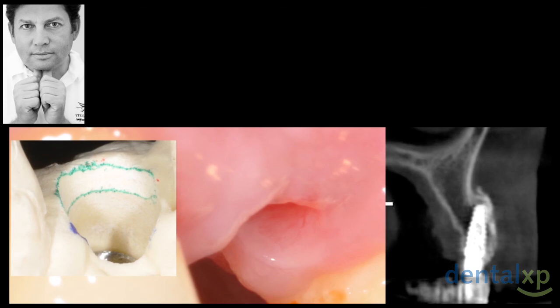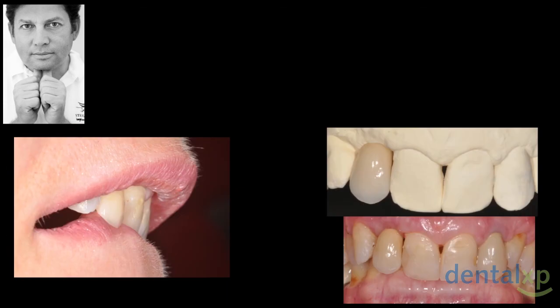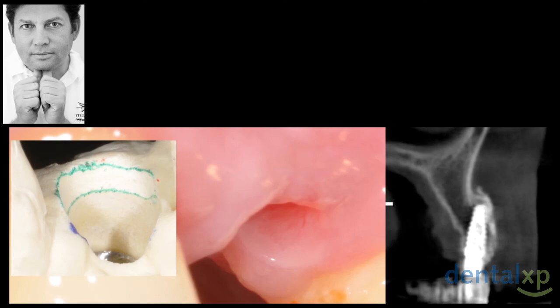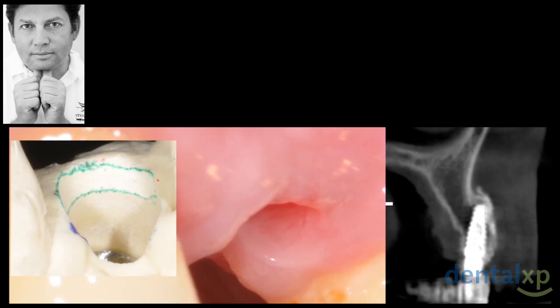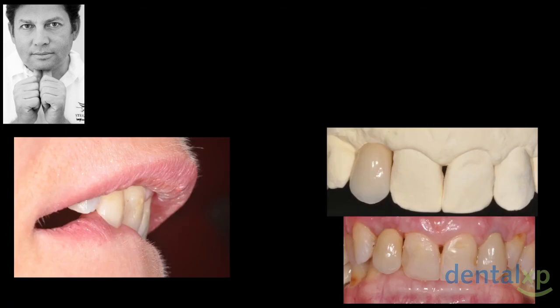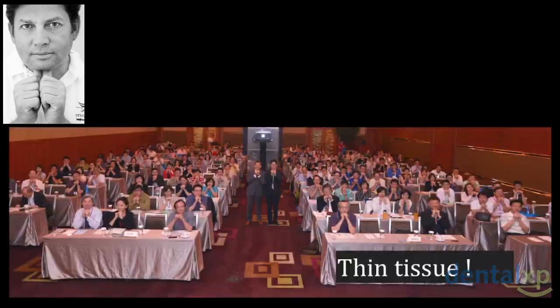Angulation helps. Now let's see if it's bigger, and then you can see here, even if you have a deep bite, you can maintain the soft tissue. Here, this is the framing, subtraction, compression, maintaining the zenith, and then avoiding recession of the soft tissue. And this is what we get. So see, we went here.